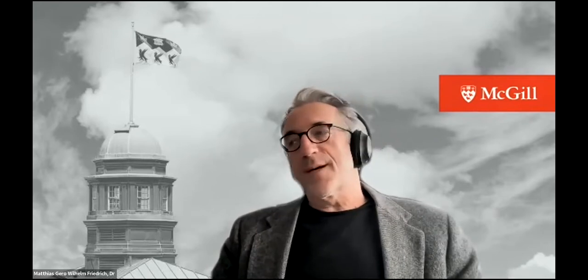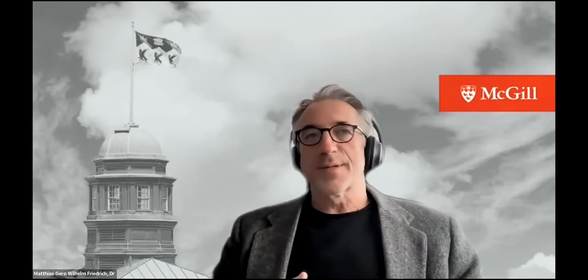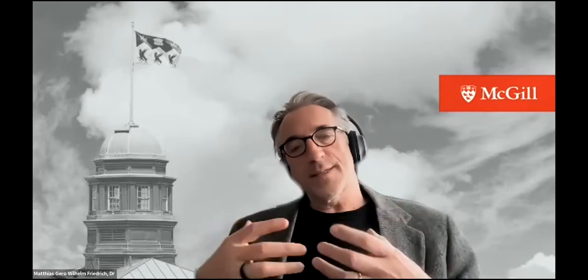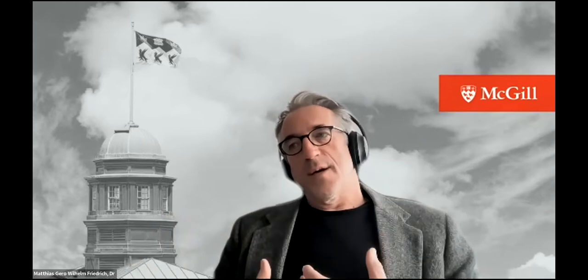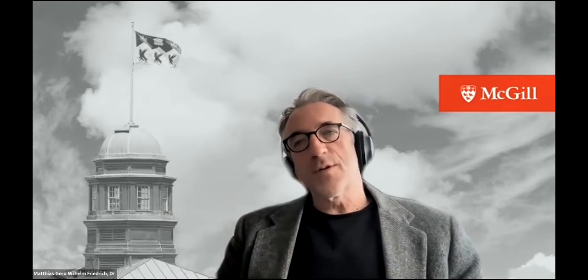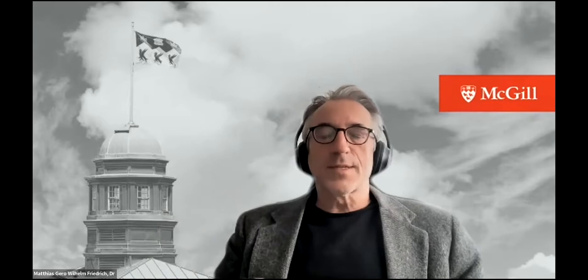And of course, for hard outcomes you need large samples, but the quantitative nature of MR may allow for using quantitative markers such as end-systolic volume index, which are quite sensitive to changes of the overall status of the patient. So it could be that these quantitative markers over time in longitudinal studies would allow enough statistical power to make a point, even with a reasonable sample size.